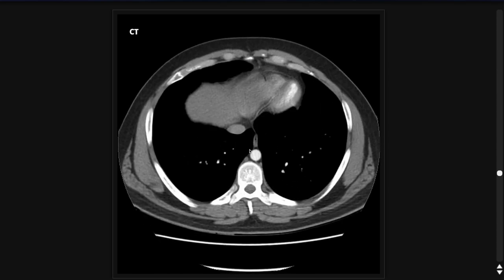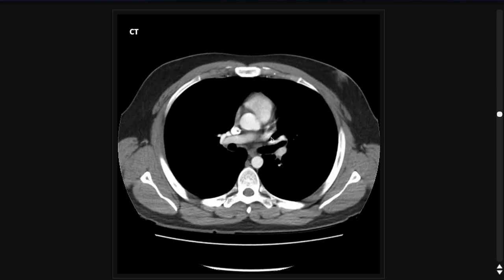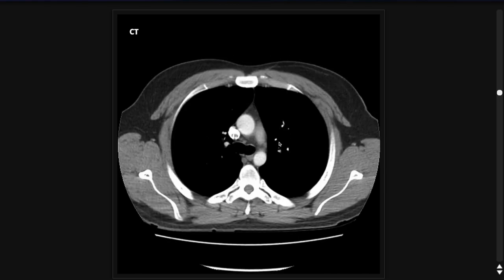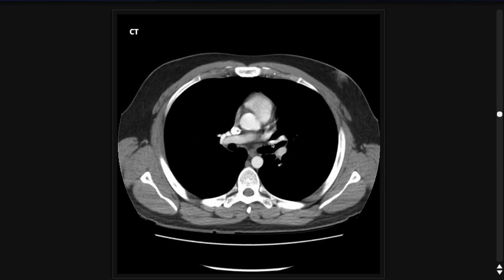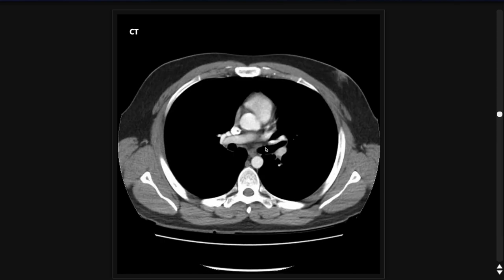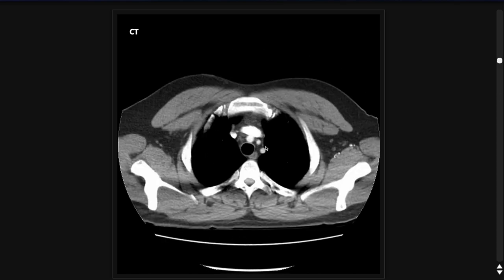Beyond the mediastinum, another place to look is the hilar region. The hilum is the medial aspect of the lung that has all the vessels and the branching bronchi, and you can see nodes there as well. In this case, I don't see any pathologically enlarged lymph nodes. The lymph nodes I pointed out are all within normal limits.